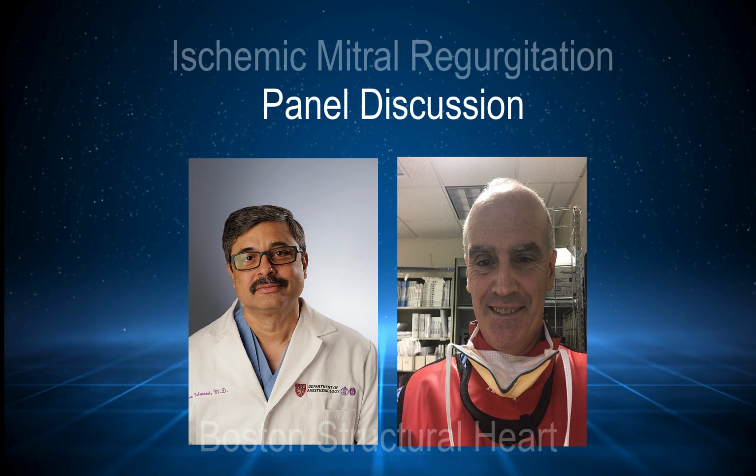So you never ignore it. I don't think that there's enough there to warrant doing a valve surgery here. And I say that for a couple of reasons and one assumption. One, prior to coming in, and I'm just going to assume that that transthoracic study was performed reasonably close to the surgery, maybe within 24, 48 hours. Correct. Or so. Because if it was done a month ago, then it's, I don't want to say useless, but not as telling. So prior to anything, he had mild mitral regurgitation.